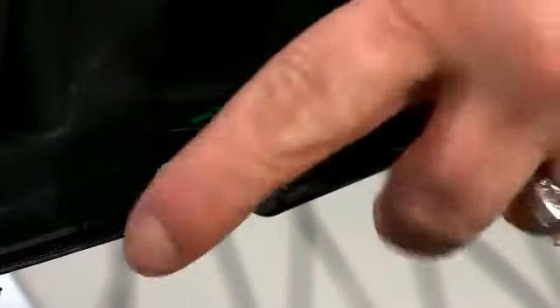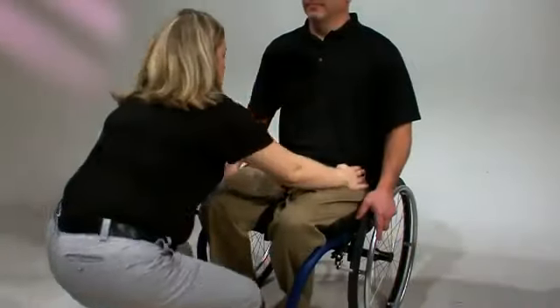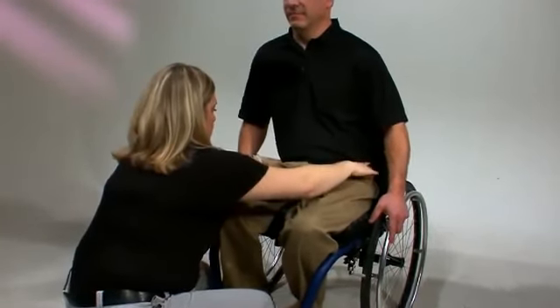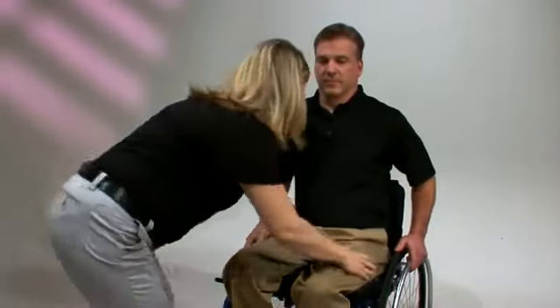With the cushion properly adjusted, make sure the isoflow green knob is in the unlocked position. Next, manually correct the client's pelvis to the desired position. For example, if the client has a flexible left pelvic obliquity, meaning the left side of the pelvis is lower than the right side, either have the patient lean towards the right or the caregiver can manually put downward pressure on the right hip until the desired position is achieved. The exact level of correction will vary with each individual.